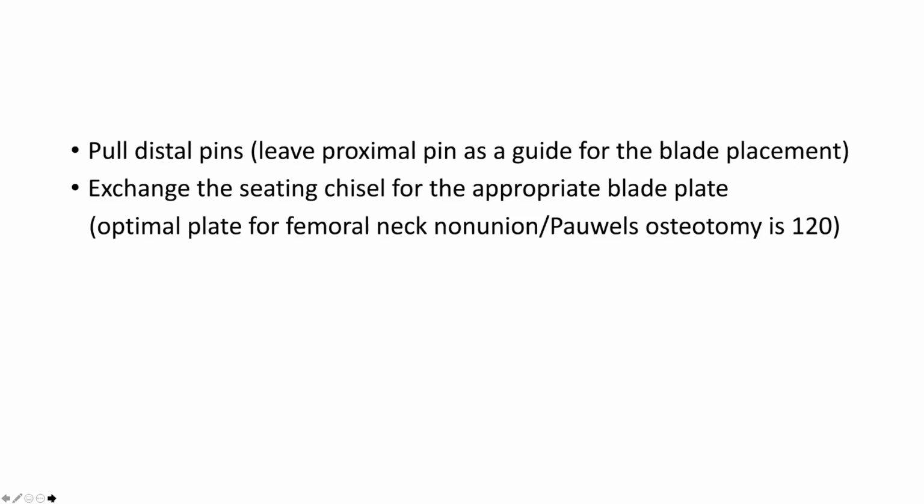Once you have those cuts, you can pull out your distal pins. You don't really need them anymore. And you can leave that proximal pin as a guide for placing the blade plate itself. It's handy once you pull out that blade plate seating chisel to have something still to guide you, because that proximal segment is now mobile and it's moving around a little bit. And then you're going to exchange the seating chisel for the appropriate blade plate that you should have already lined up based on your preoperative plans.